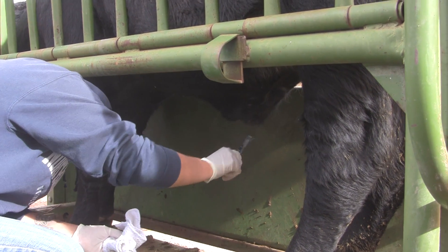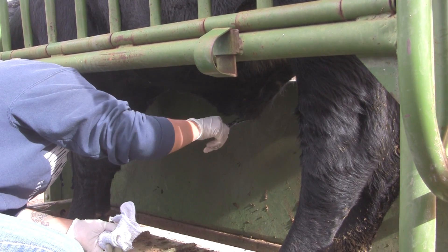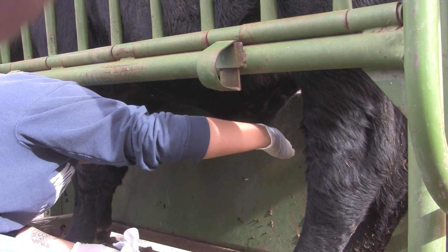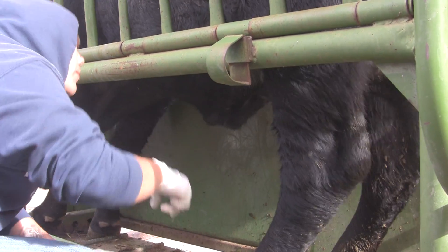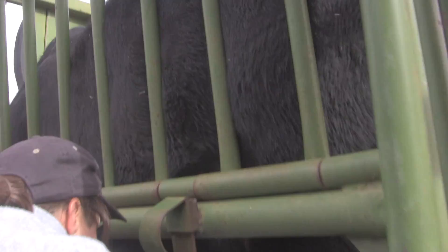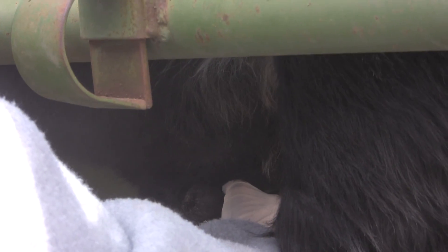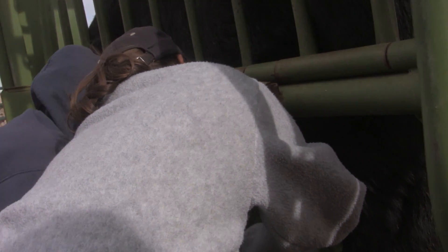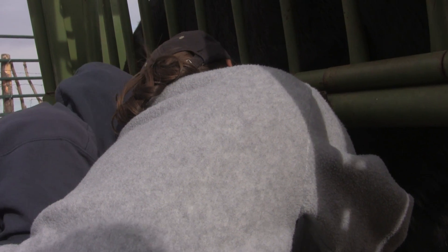We want to make sure that we've got the longer hairs removed and any type of organic matter debris. What I want you to notice — see that manure? You want to make sure you get that off, and you're going to wipe all that clean. It's just like doing a surgical prep almost. Same idea. You're going to rub it away from the opening of the sheath.